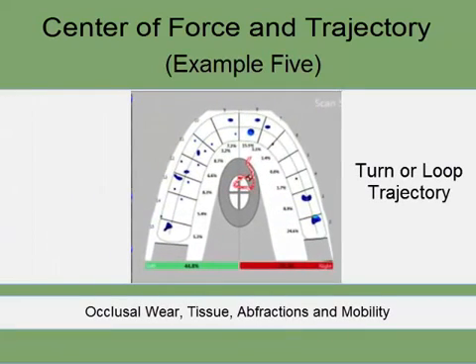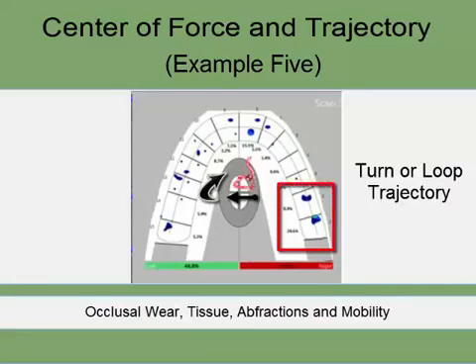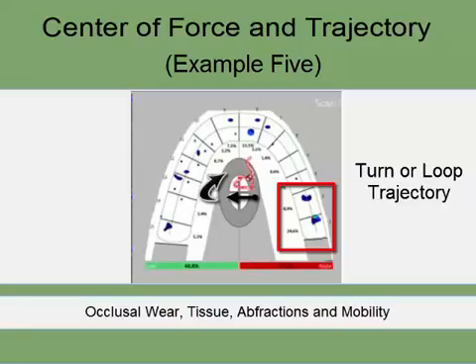In the last example, during a left excursive movement, the force initially moves horizontally but quickly loops around back towards the right posterior teeth. This results from a significantly forceful balancing interference present on tooth number two. Patients with this looping center of force trajectory are predisposed to hyperactive muscular TMD symptoms, tissue recession, infractions, and mobility.